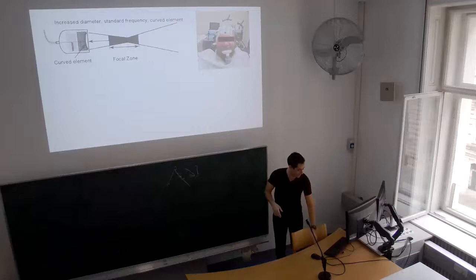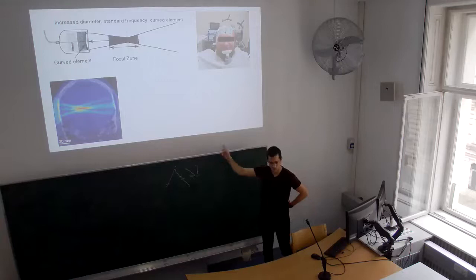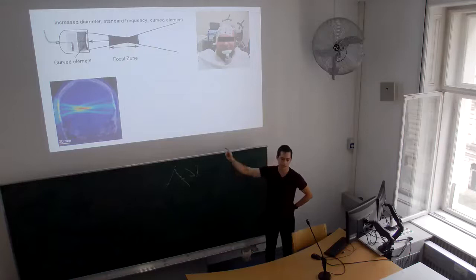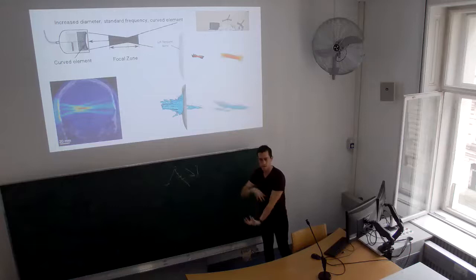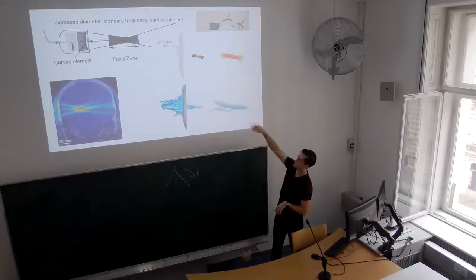If you do this right, you pass energy through the flesh, through the bone, and you generate a little focal point inside the head. It should be noted, and we'll talk about this in more detail, that bone is a major barrier. So we have to understand how much of a barrier it is and try to account for this. These are simulations I've run. On the top, this is just running it in water, so everything's identical, and you get this idealized little focal point.